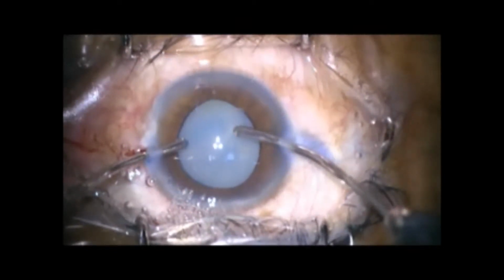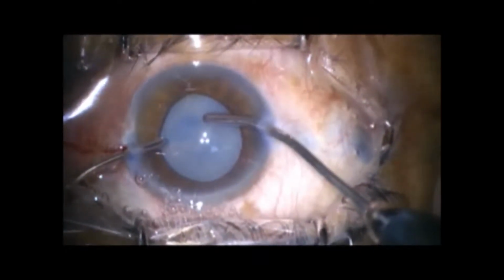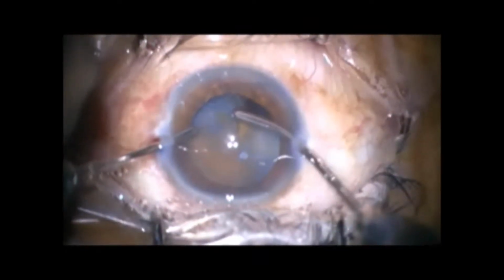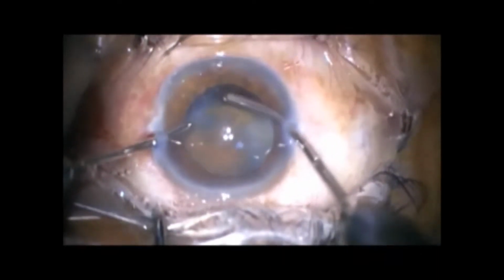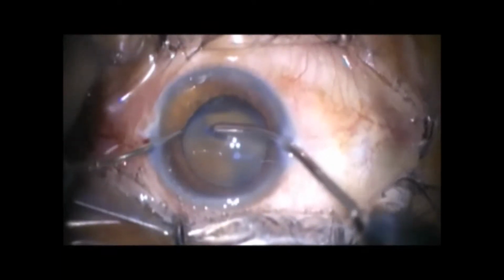With the same cannula, the anterior capsule is lifted till it folds back on itself. Now the leading edge of the anterior capsule is held and continuous curvilinear capsulorhexis is fashioned.